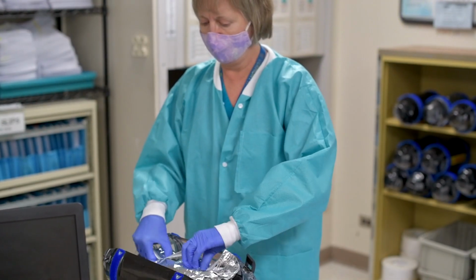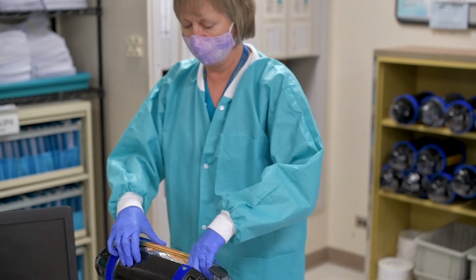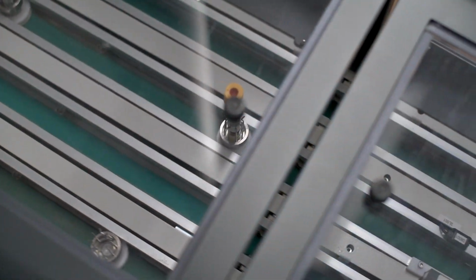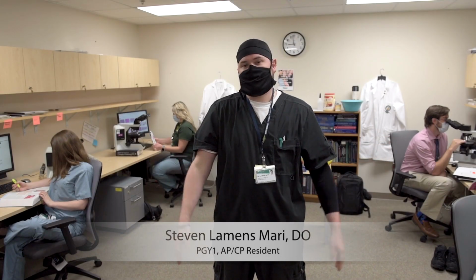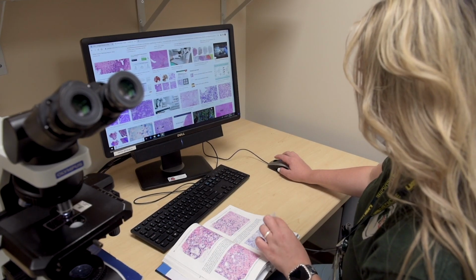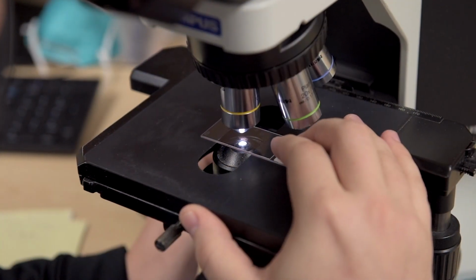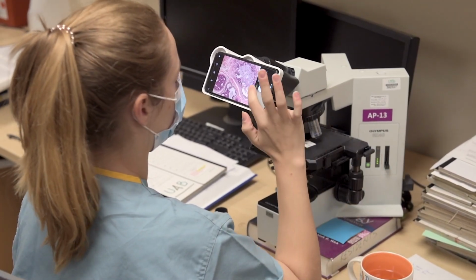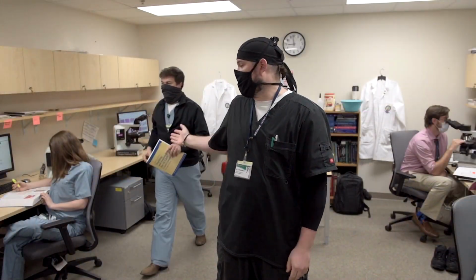We're in the core lab where samples are received, particularly through our tubing system. Once a specimen is received, it is accessioned and placed on a conveyor system where it will be sent to its respective areas for processing. I'm just going to show you around the AP resident room, which is where you'll spend the majority of your time when you're on AP services. And even if you're a medical student or even in a different specialty, we have people rotating in and out all the time. And we're just one big group in here learning together.